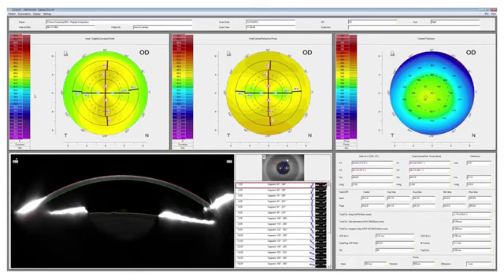We also look at higher order aberrations, which is important for assessing not only corneal quality, quality of vision, but it's very important for multifocal IOLs or extended depth of focus IOLs. We also look at spherical aberration, and we look at what we call chord mu, which is related to angle kappa, and that's also important for any kind of multifocal or extended depth of focus IOL.